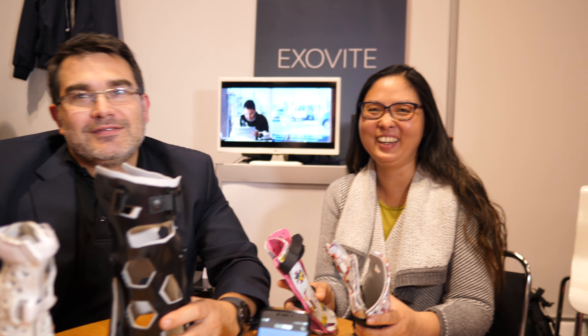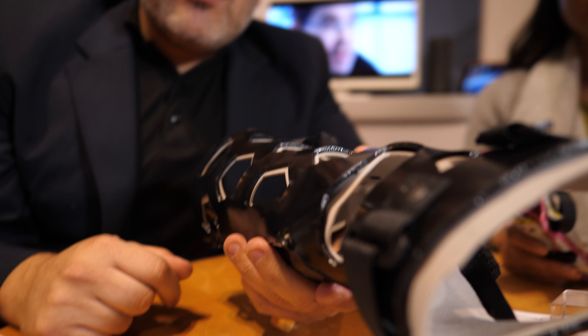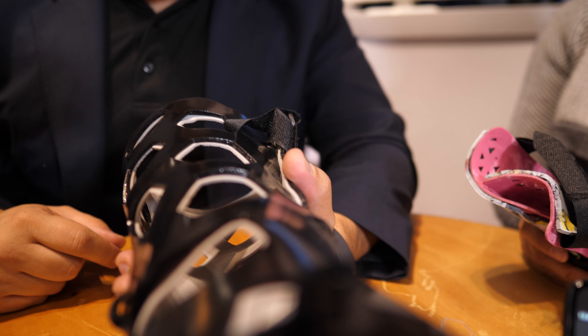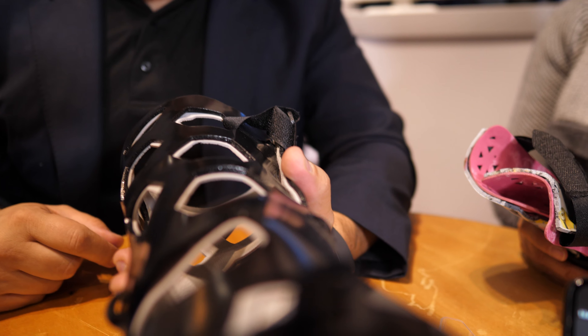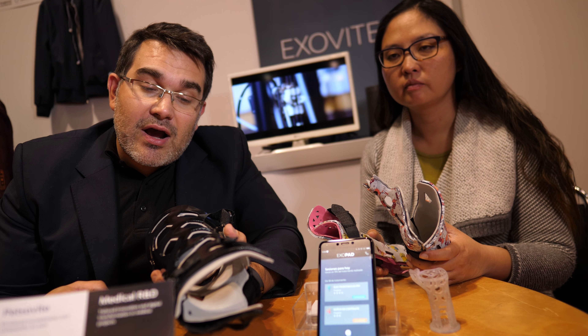What are you showing here? This is a special kind of 3D printed splints. The technology behind this is a really good one because we can create this kind of splints in five minutes, only scanning the surface of the arm of the patient. And we can include different technologies or different uses. For example, if you have a surgery, we can create a specific hole — you just need to draw a hole in the surface of the arm of the patient.